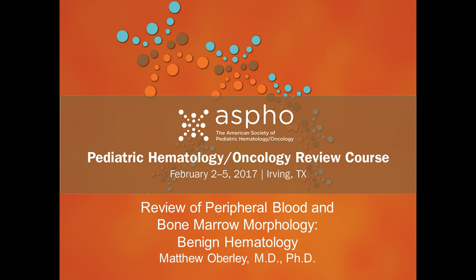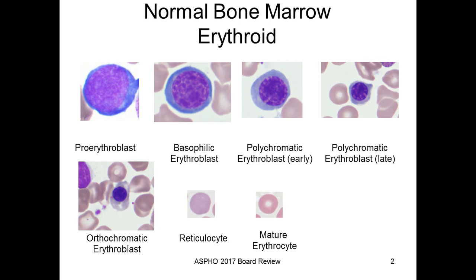Thanks for the opportunity to present. I'm going to be presenting a review of peripheral blood and bone marrow morphology, and this will be focused on benign hematology. And so I wanted to spend a little bit of time talking about and reviewing the normal bone marrow cells.